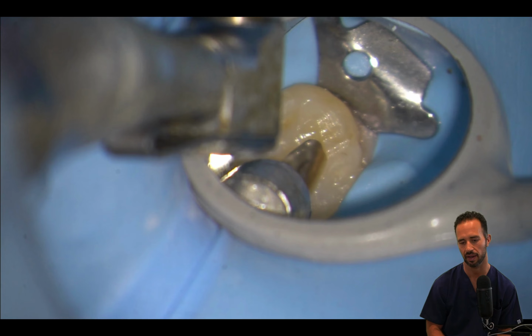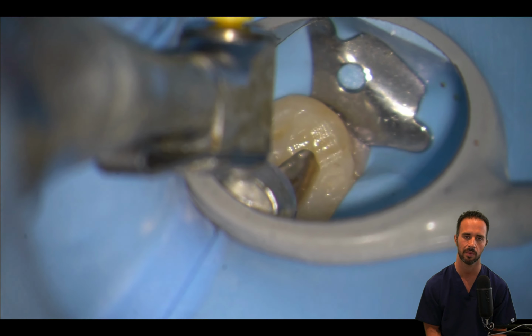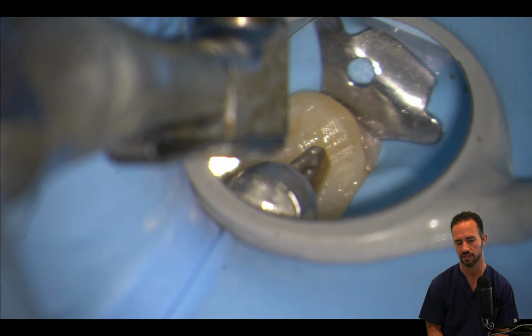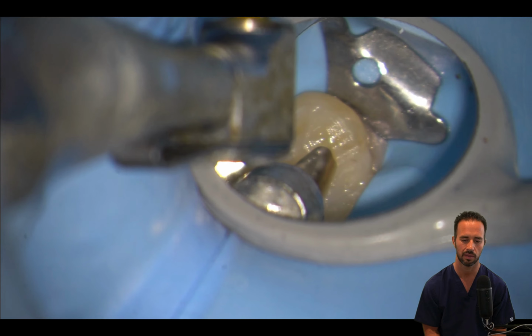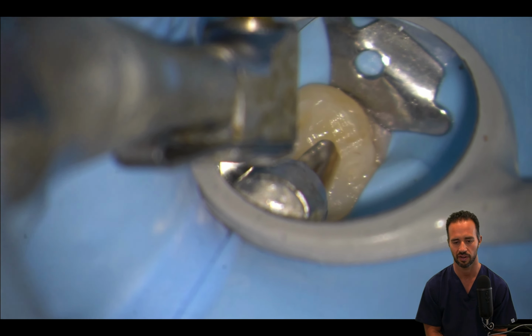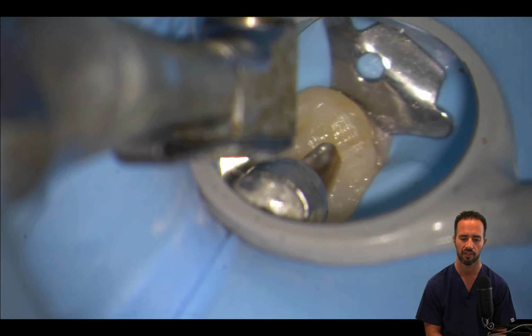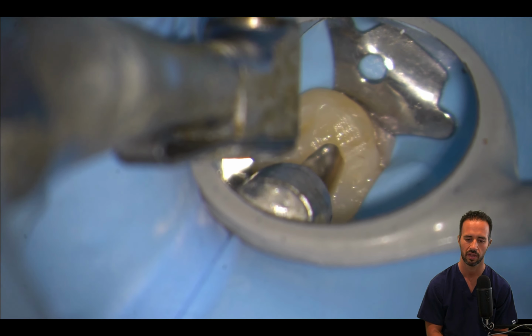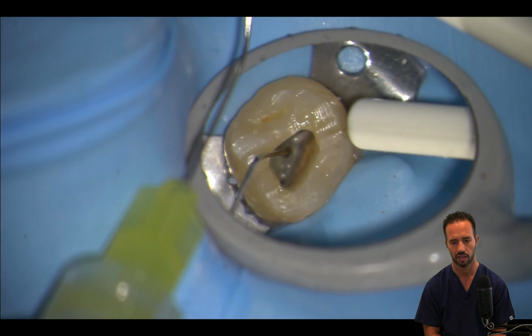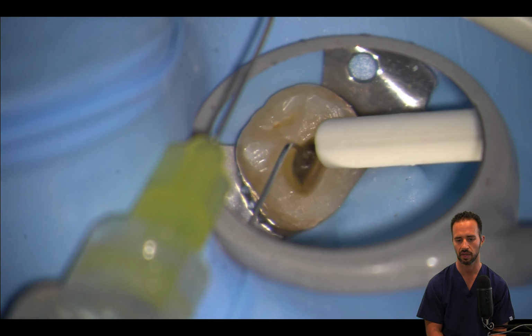And it's a gentle peck because if it's blocked off, you can very easily break the tip of the orifice opener, which is not the end of the world because it can very easily be removed unless it falls directly into one of the open canals. That's very unlikely. So I'm just pecking in the area, trying to see if my orifice opener wants to drop into an MB2 canal. So far, nothing. So I'm going to just remove some of the dentinal mud and continue my search.